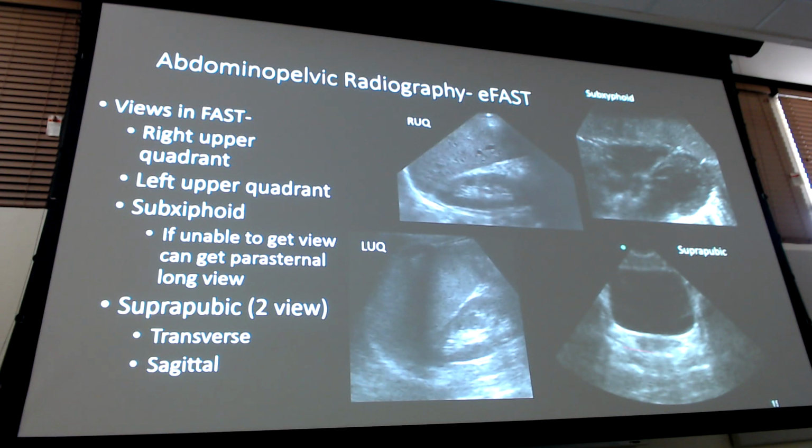Same thing with the bladder. What's this down here called? What do we call that? This bright white area? The posterior acoustic enhancement. Right? It is hyperechoic compared to the fluid in the bladder. That is true. It is hyperechoic when you compare it to this area. But that's that posterior acoustic enhancement because the bladder is full of fluid, and so we end up getting that.